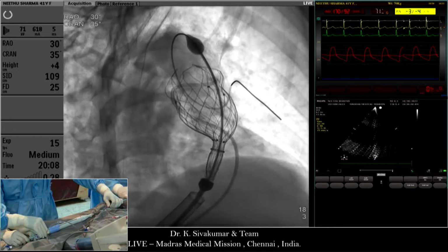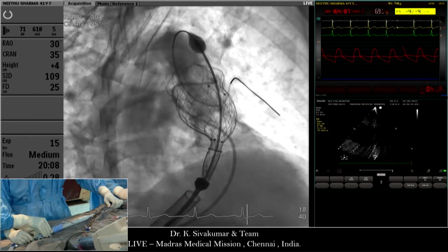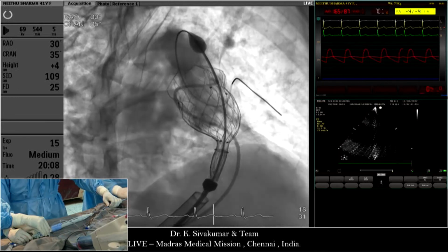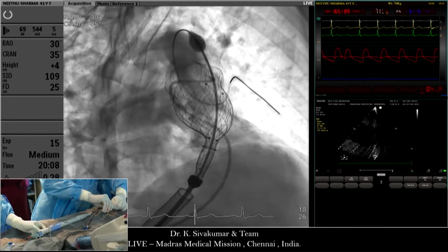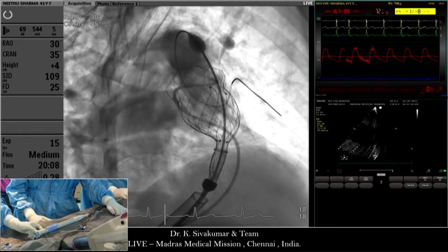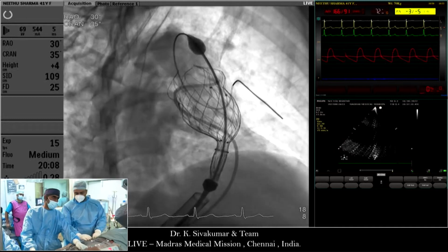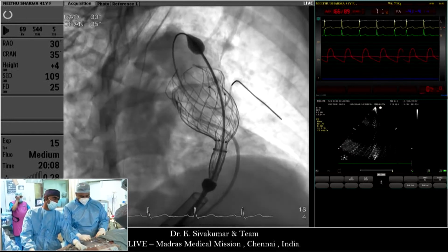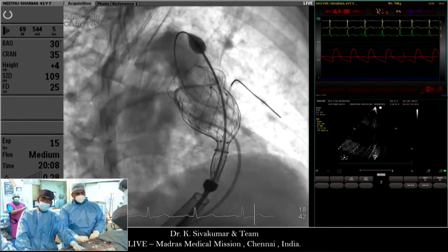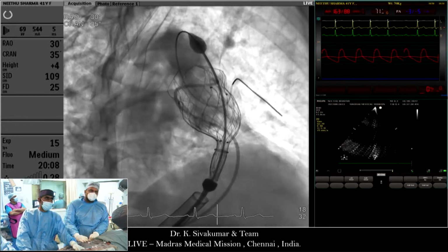Okay. See, now probably I will not give a forward push because I have started opening in the distal outflow tract. We have to remember that this distal MPA was much larger, 37 to 38. So I will load a little bit more contrast in the injection. Varakan, what do you think about this last angiogram? Yeah, I think somehow the valve is a little bit distal. But at the moment, if I were you, I may try to keep pushing the wire a bit in order to allow the flare to come back just a few millimeters.